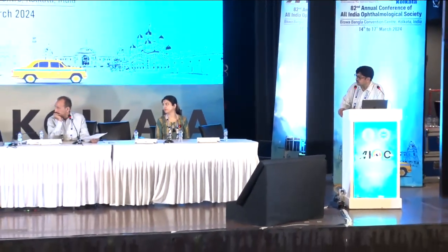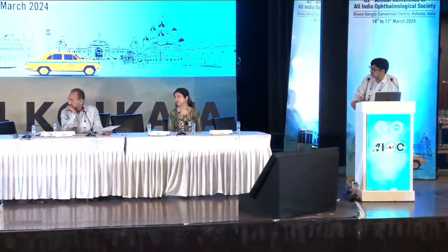Okay, intensity. The reason for the 40 kilohertz selection is that it is the phacoemulsification frequency, and it is time tested and safe for the eye and for the uveal tissue. That's why we selected the same. And the effect of hypotony induced by this kilohertz is already well reported and documented in the previous literature.